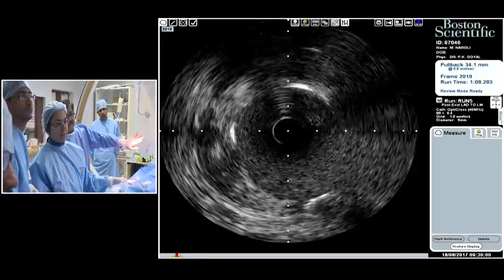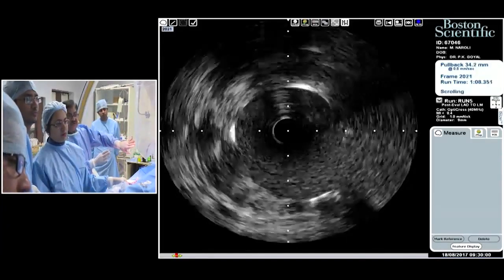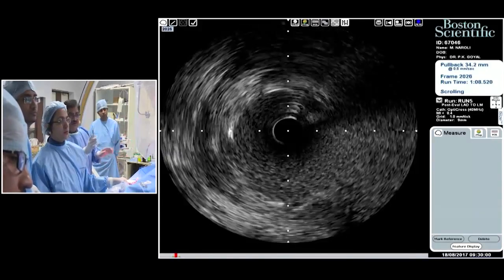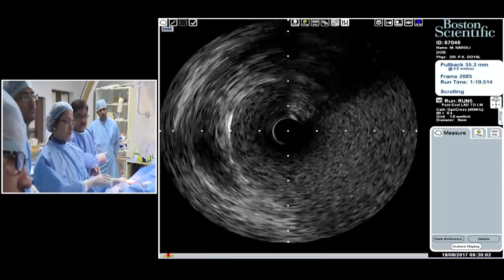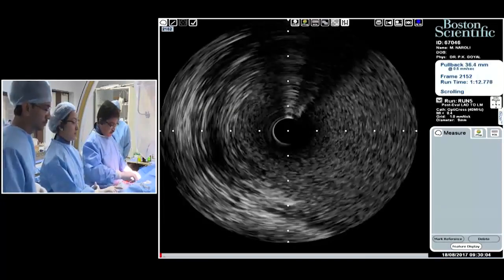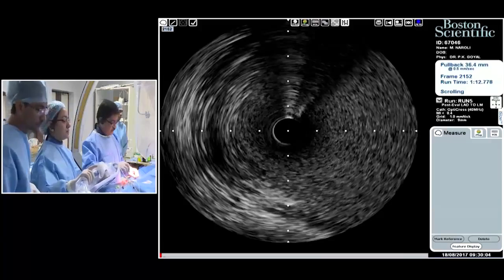Play the last withdrawal till we are coming out. You see stent struts till we are out of the stent. And now, still we are out. Wonderful. Still further, done, yes, Dr. Goel. So no stent there. So that is absolutely on the ostium. Okay, that's a very good demonstration. I think with this we can end this procedure.